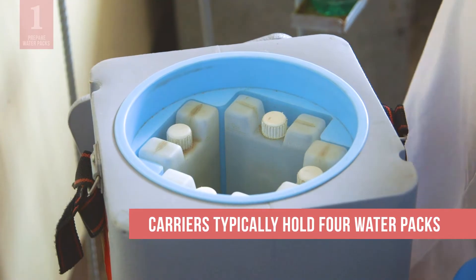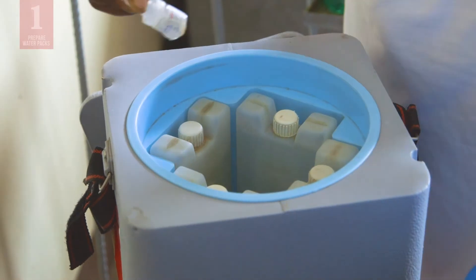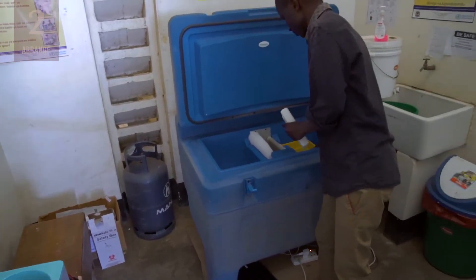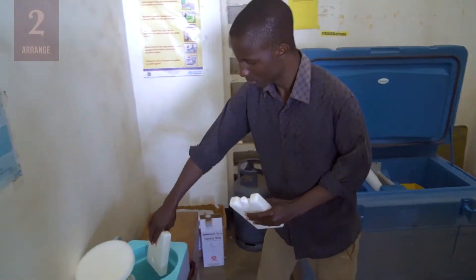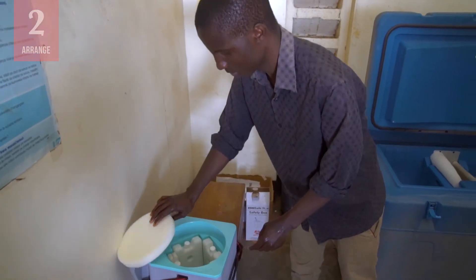Vaccine carriers typically hold four water packs. If you are not sure which packs to use, look inside the lid of the carrier. Then arrange the prepared water packs in the vaccine carrier exactly as shown in the manufacturer's instructions on the inside of the lid.